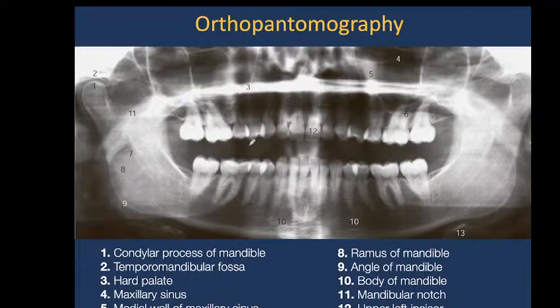Another method to see tooth position and diagnose dental orientation of all teeth is orthopantomography.